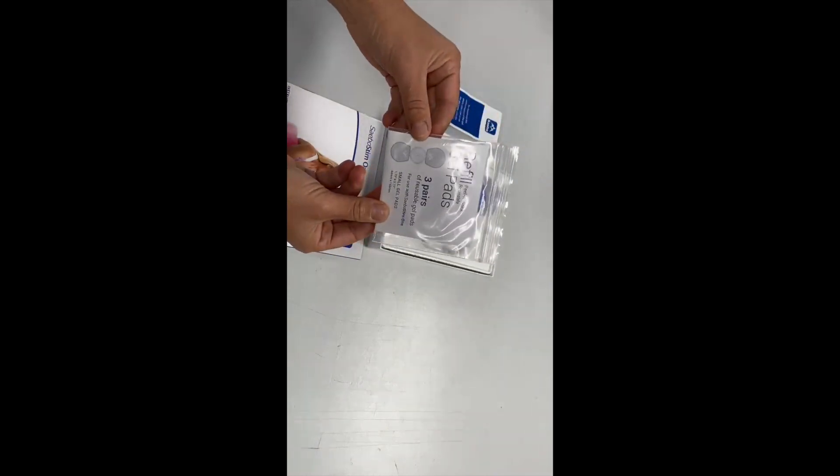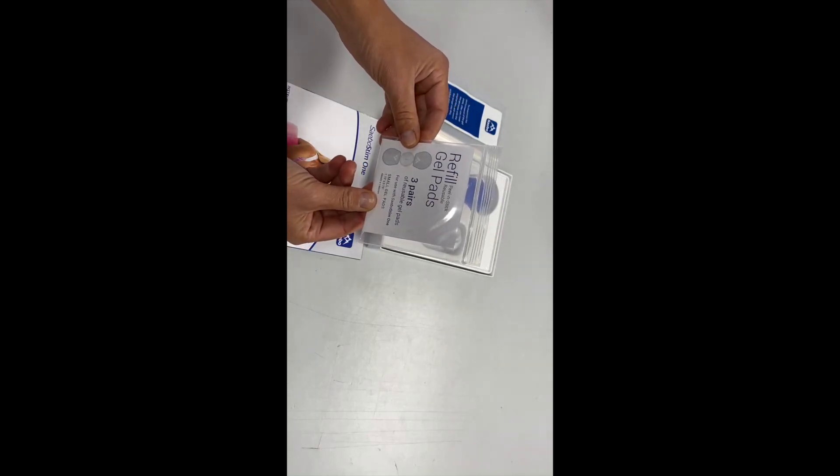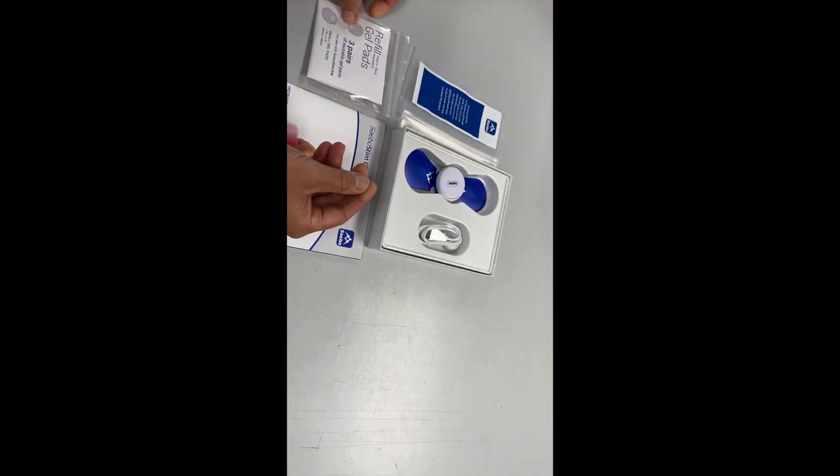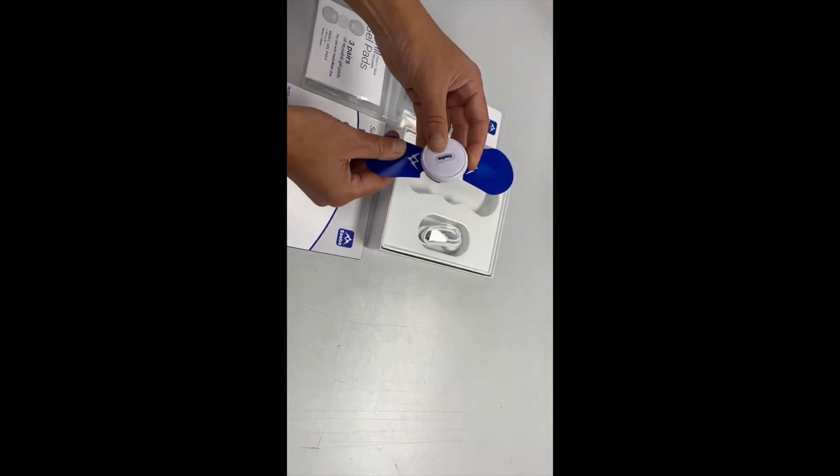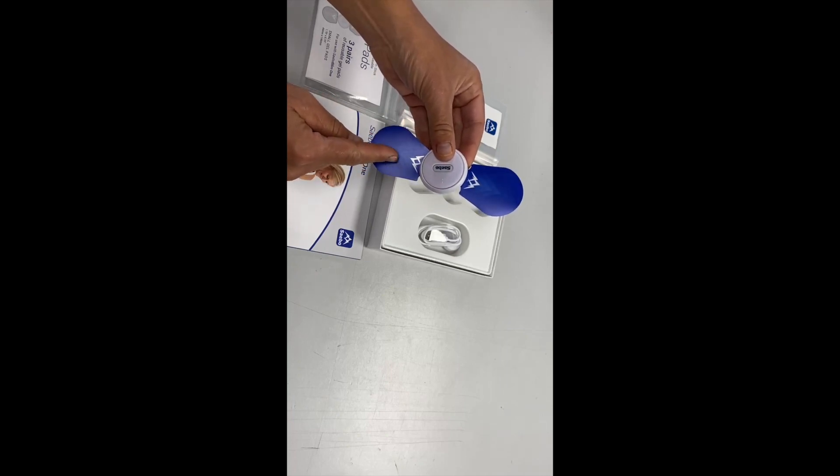You've got a pack of replacement gel pads. In this case these are small because it's a Sabo Stim 1 small. We've got the device itself: white power disk and the blue wings, which are small.